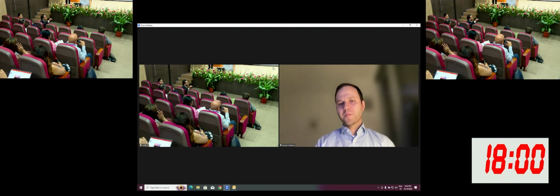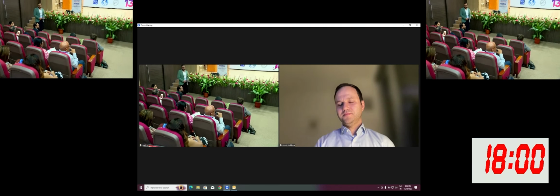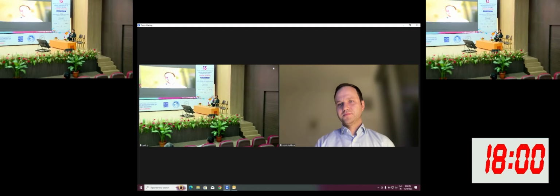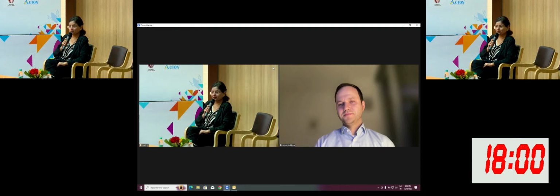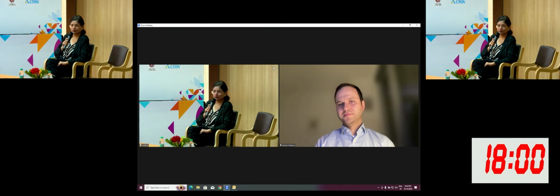I agree. That is not our primary role. We are diagnostic radiologists. We are there to diagnose disease. But the problem is that because of the calcium shadowing, any echo study, as we know from every ultrasound study, always overestimates the amount of stenosis. And we, on the contrary, do a much better job of it. But at the last minute, are you going to just defer the TAVR and throw them up in the air? Well, your cardiologist is not going to like you very much.